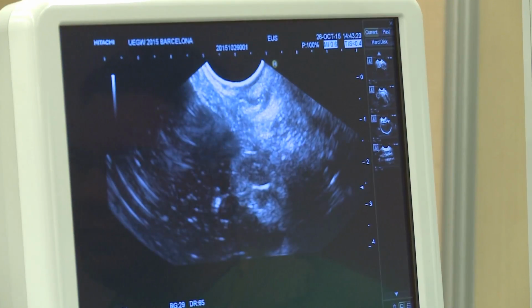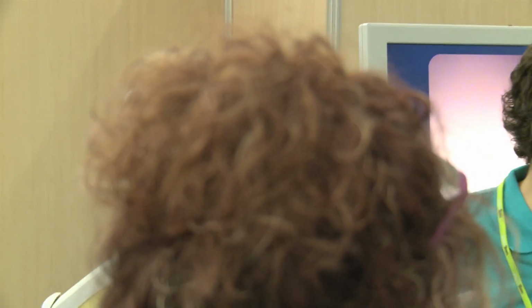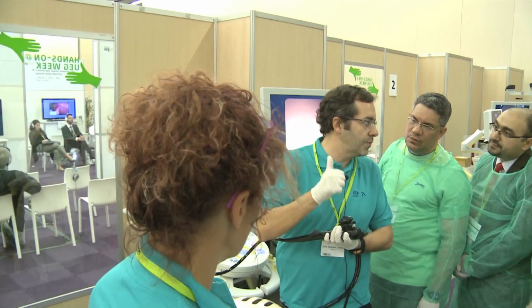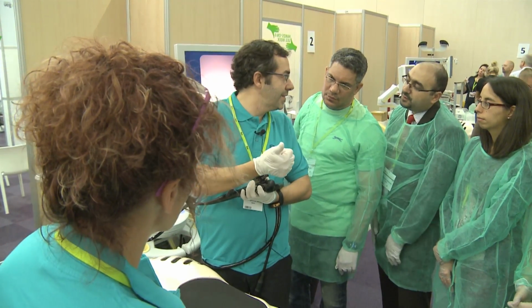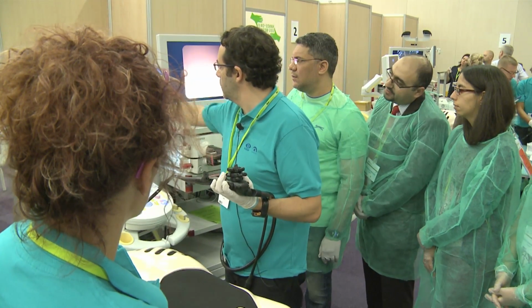I think the best way to start with the technique of FNA is with the diagnostic approach. You can be very good in the technical approach to anything, but first you need to know and find what you need to puncture. If you do not find it, you will not do anything. So we found what we want to access.